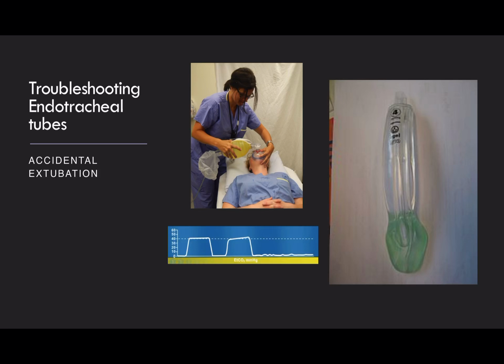This is something that all BLS and ALS providers have been trained with. The other option is, if the patient is unconscious or heavily sedated, you can put an i-gel down, and these are good temporizing measures until someone who is more airway trained can come along and take control of the situation. The key thing to emphasize is do not panic. Just because a tube has gone out doesn't mean that you can't oxygenate that patient, and that is the priority in these patients.